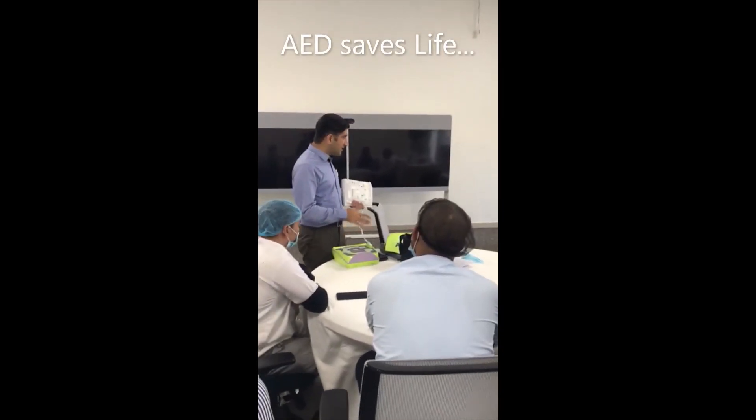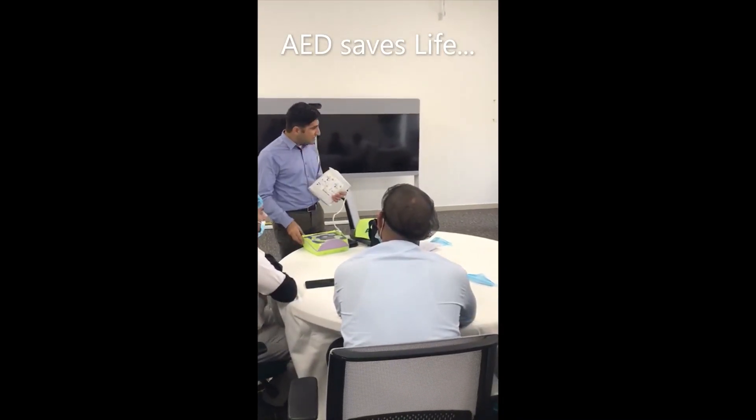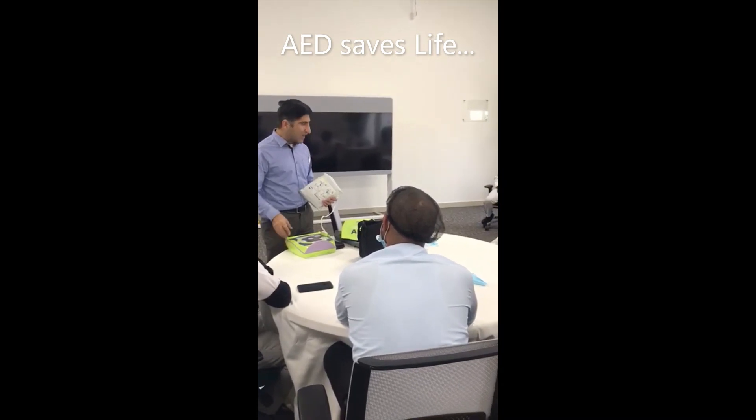This is an AED — Automated External Defibrillator. So here we need to turn it on. I have turned it on.